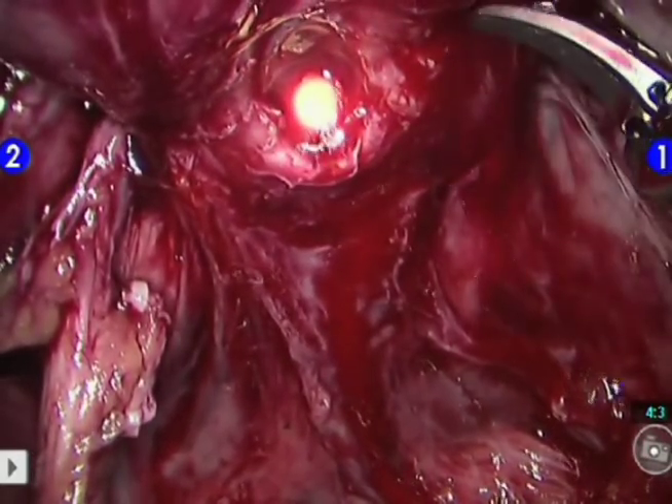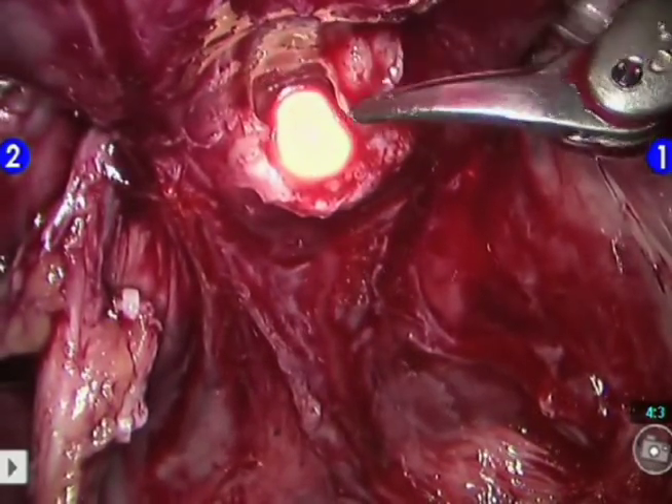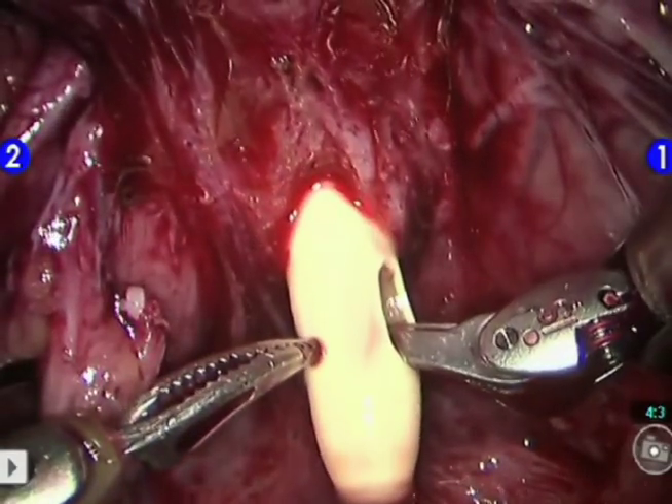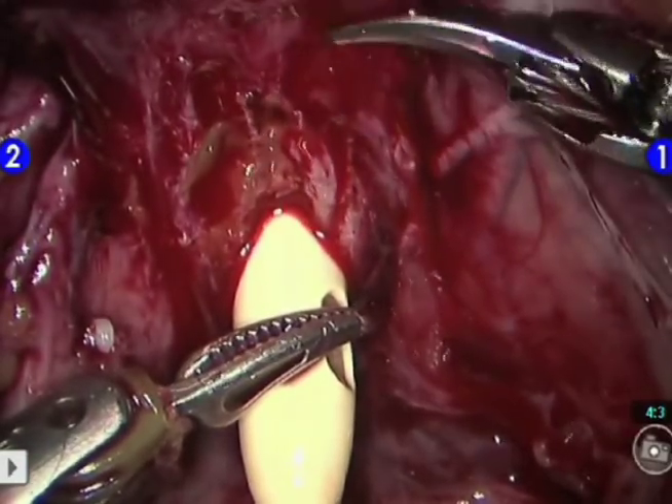This also exposes the anterior wall of the urethral mucosa and the muscular wall. Using blunt and sharp dissection, the urethra is divided circumferentially. At this point, all the muscle fibers are transected and the DVC is left attached to the anterior surface of the prostate.